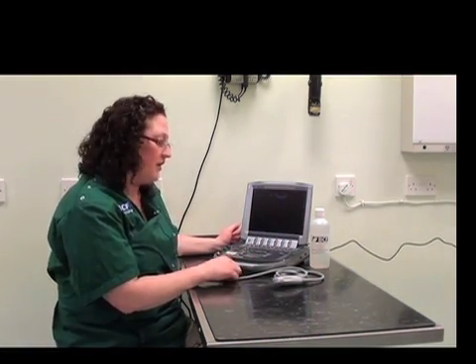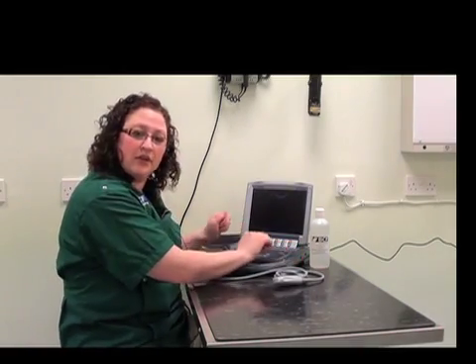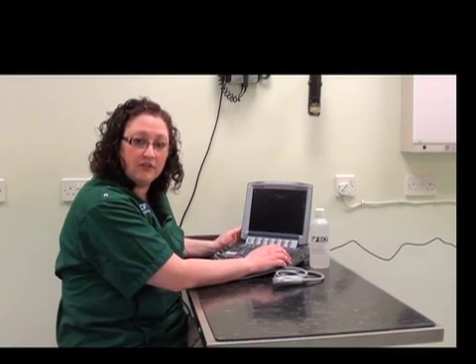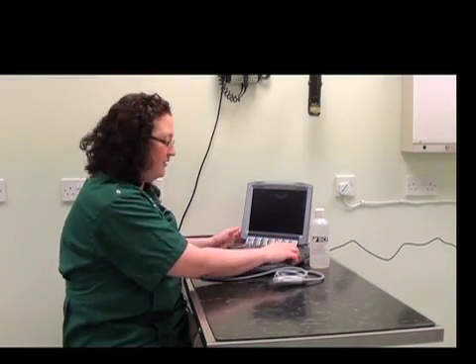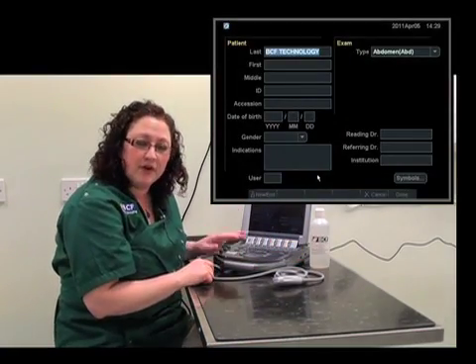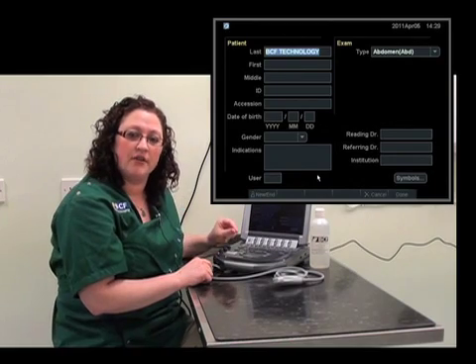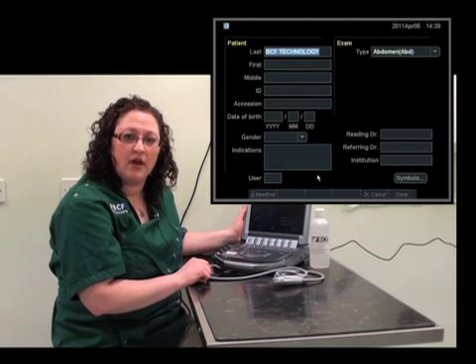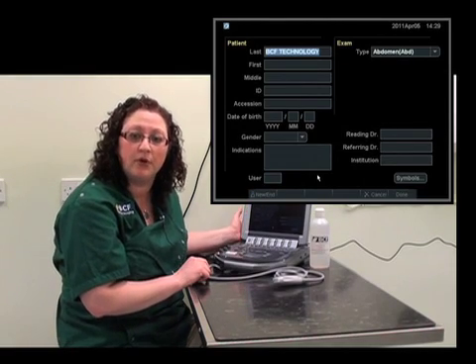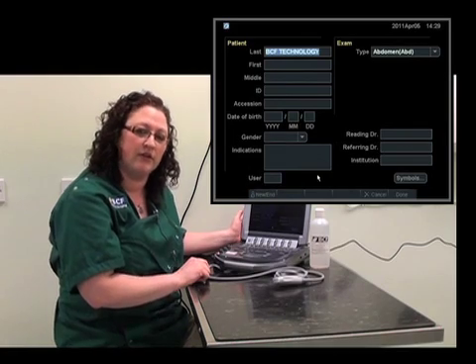The very first button you'll want to know is the patient button. It's located somewhere on the keyboard depending on what type of machine you have. On this machine, it's located up on the top right hand corner. It's very important to always include the pertinent information regarding the patient — usually name, date of birth, and also a specific patient number for the clinical record if you have one.